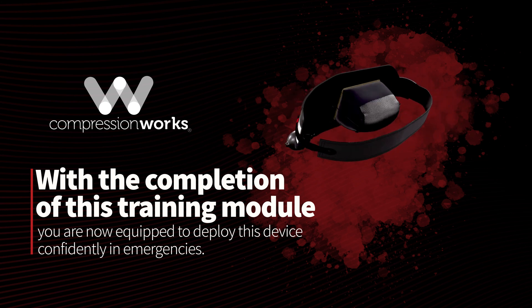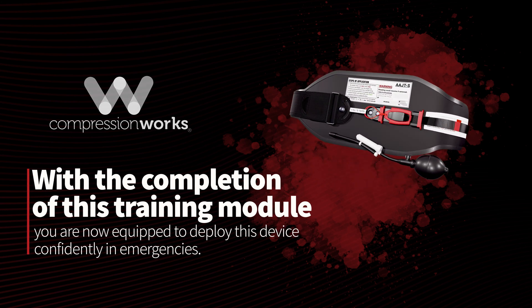With the completion of this training module, you are now equipped to deploy this device confidently in emergencies.